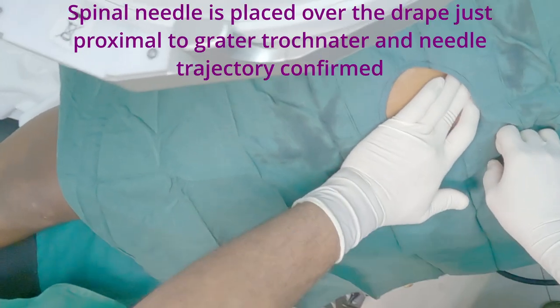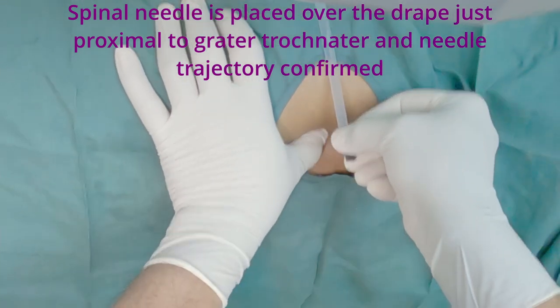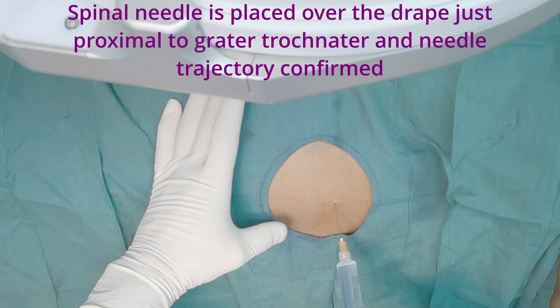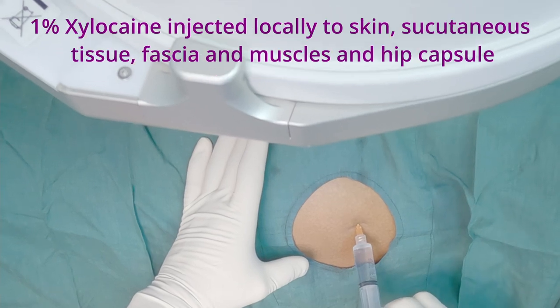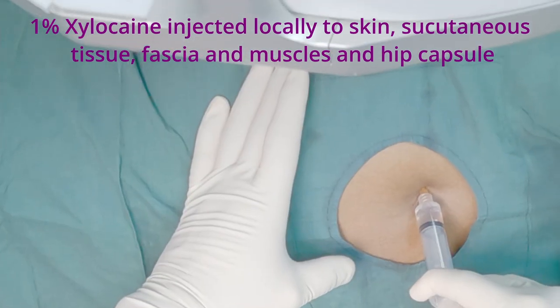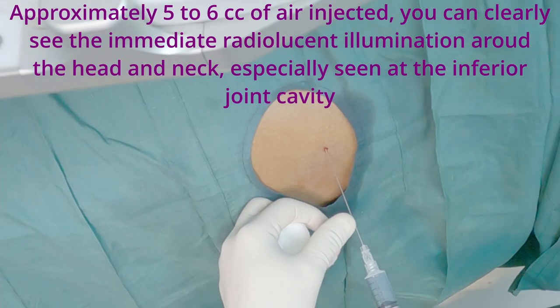I am palpating the tip of the greater trochanter. The spinal needle is placed over the drape just proximal to the greater trochanter, with needle trajectory confirmed under fluoroscopic guidance. 1% xylocaine is injected locally to the skin, subcutaneous tissue, fascia, muscles, and hip capsule.